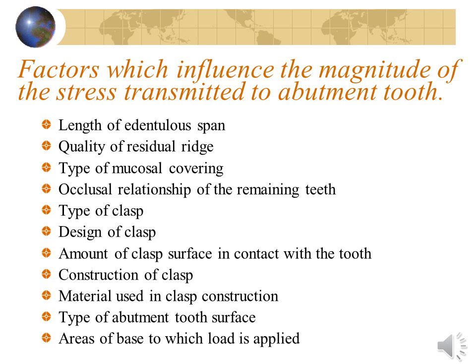Next is amount of clasp surface in contact with the tooth. A clasp should be designed so that the reciprocal arm contacts the tooth before the retentive tip passes over the greatest bulge of the tooth during insertion. And it should be the last component to lose tooth contact during removal of the prosthesis.